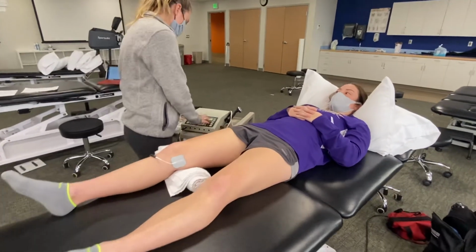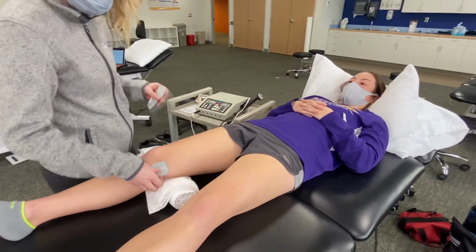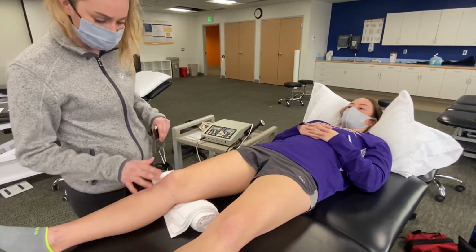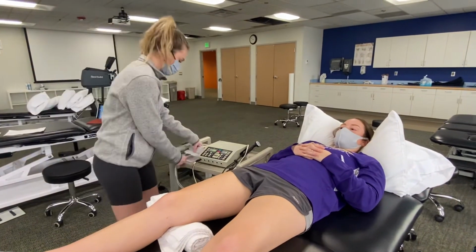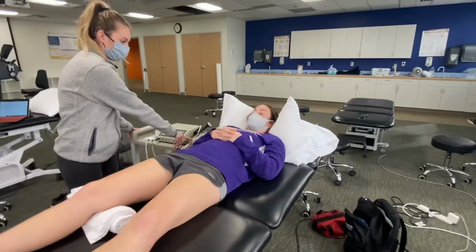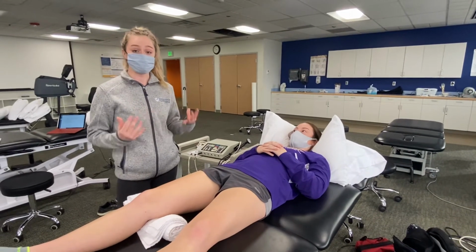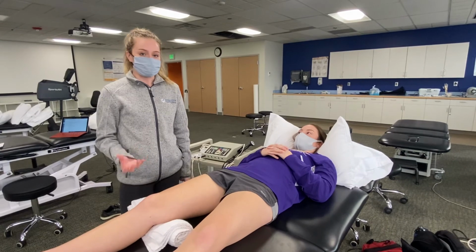Okay, I'm going to stop it there and remove the pads. All right, and I can observe the skin now and make sure there's no irritation, it's not red. It looks very good, so I'm happy about that. And so how did that whole thing feel? Is it something you want to do again in the future? Yeah, it felt really good. Okay, sweet. So we can continue to do this when her pain flares up, and also at the end of treatments, just for the pain to make it feel good.